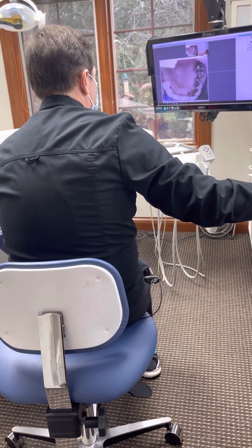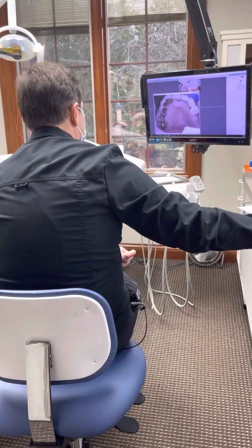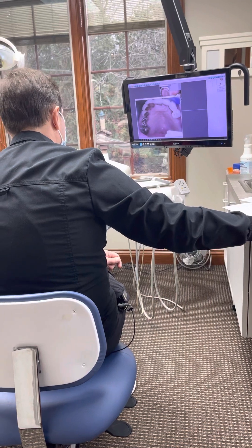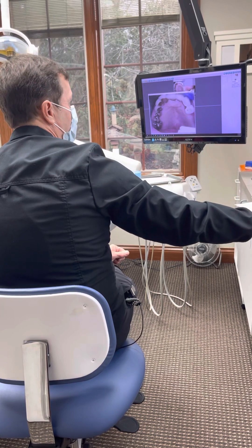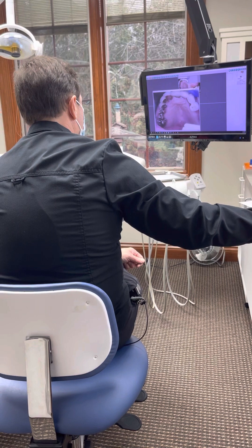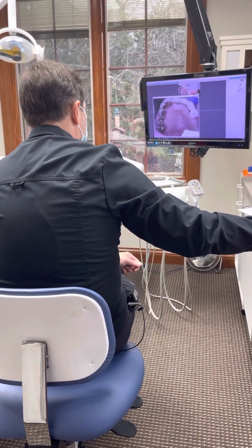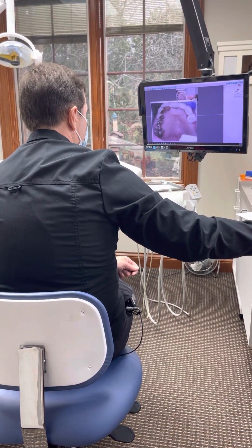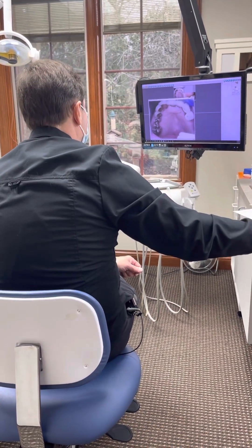Good job, Karen. So here's the bridge we're talking about — these four teeth right here. The whole left side of your mouth. She doesn't have anything over here, so we're talking about the remnants of this. This is a good tooth right here, this one — that one's broken, this one's broken. These need to be taken out, so we have to cut the bridge off.